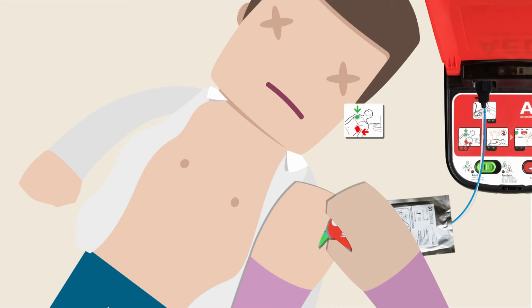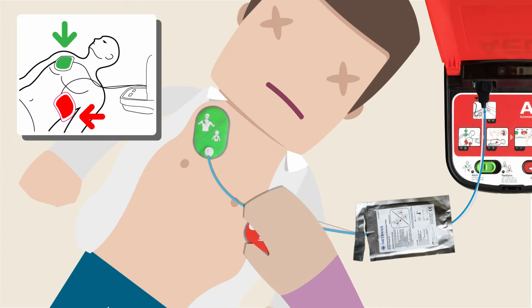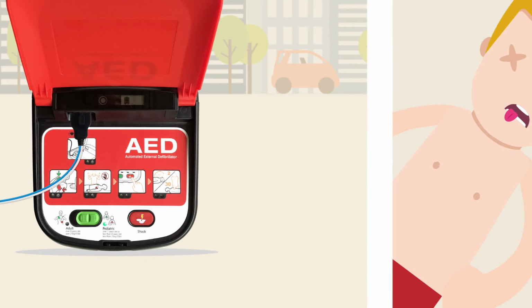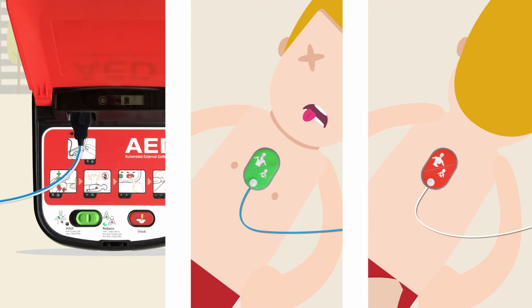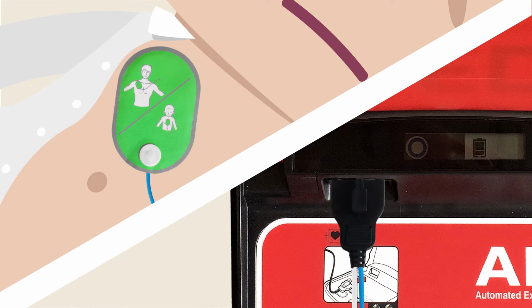Using the picture guide, place the green pad under the right collarbone, then place the red pad beside the left nipple, just on the ribs below the heart. If the person is 1 to 8 years old or weighs less than 25 kilograms, press the switch to pediatric and apply the green pad to the chest and the red pad to the back. Make sure the sticky pads have good connection with the skin. If the connection isn't good, the machine may repeat the phrase, check electrodes.